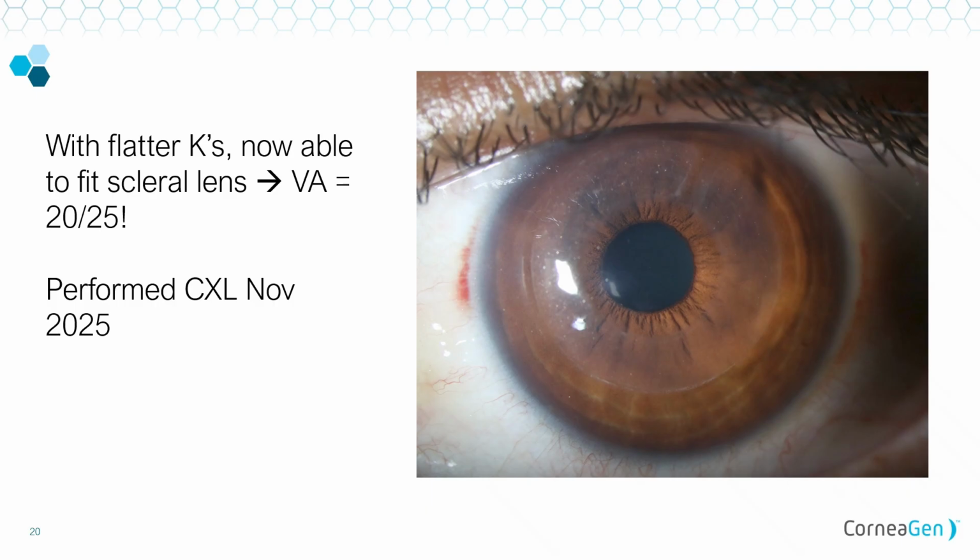So we talked already about patient selection. I'd say moderates, right? Avoid too peripheral a cone to start because again, it's not centered on the pupil, it's centered on the cone. If you're really peripheral, you can push that CTAK inlay out towards the limbus. It'll be a little bit harder for you to dissect. So do a few more central cases and then take that on later.